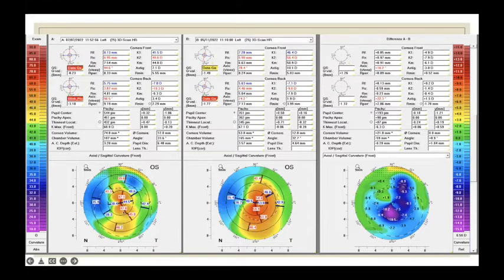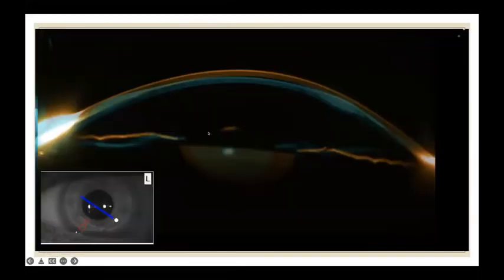And you can see it's really come to much better levels, 47 and 47, from ranges of 54, 59 and 10, 11 diopters of flattening here, with the decrease in almost all the parameters: K1, K2, K mean, astigmatism, everything really improved a lot. And the patient really was very happy with this vision, even though it was just the first post-op day. We did combine with cross-linking and there was still some haze that has to go because this was just done a few days back.